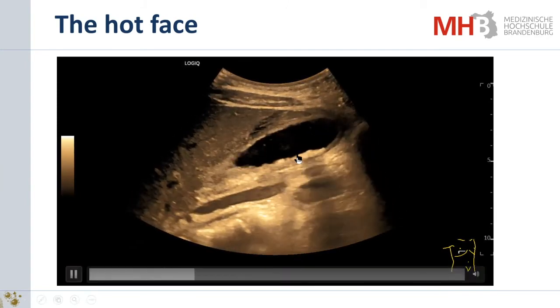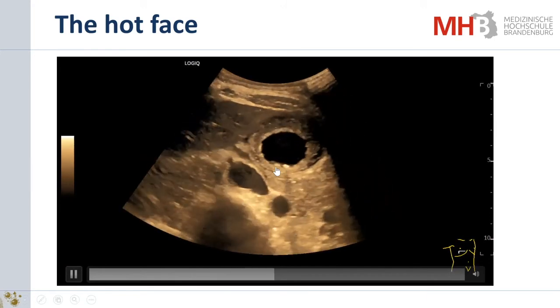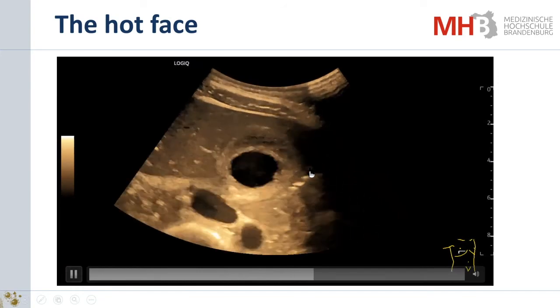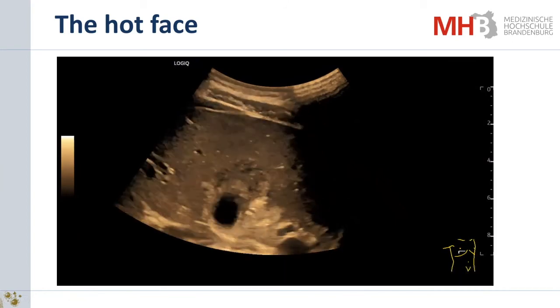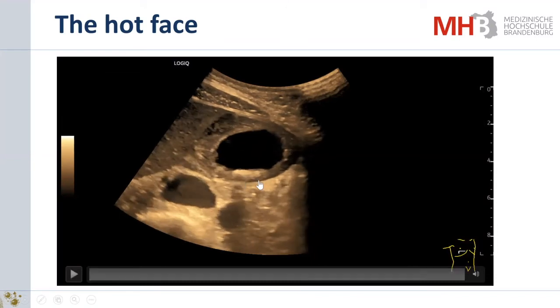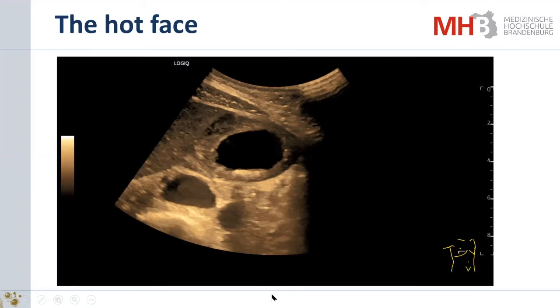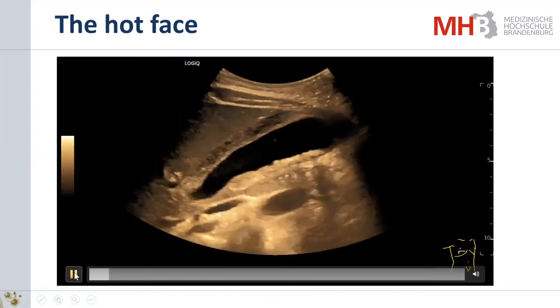There are several pathologic findings. Here's one, and the other is here, and the third is here. No ideas? Okay. Then let me tell you that these echogenic reflexes causing small shadows are very small stones. Excuse one comment in chat. Okay. Small polyps. Another wrote sludge. Okay. It is in between.